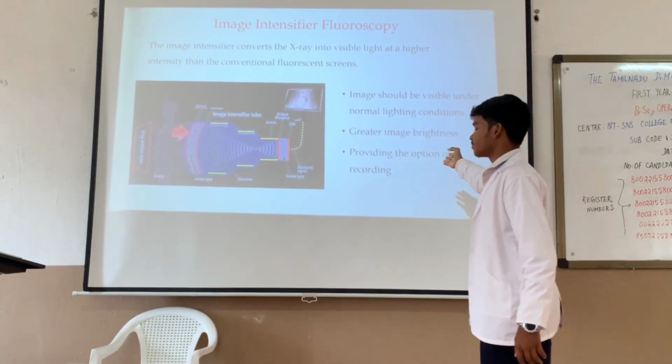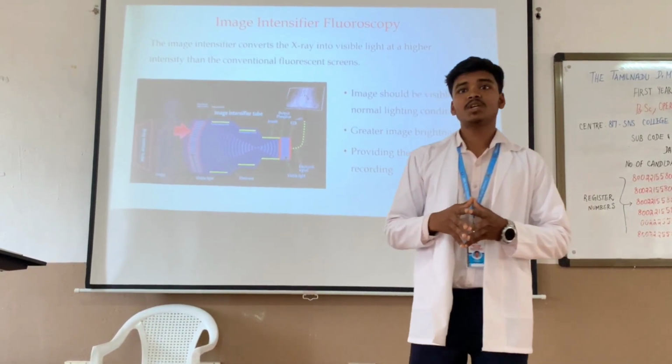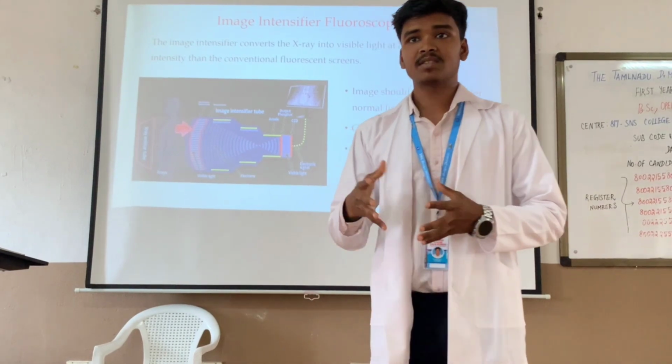They also provide the option for recording. So you can record the image for future diagnosis.